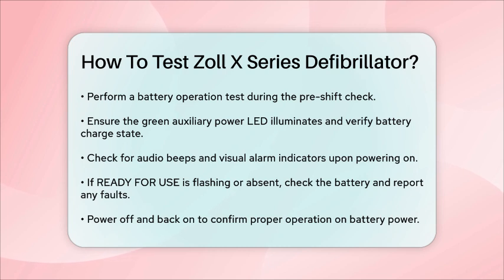Finally, power off the device, then power it back on to ensure it operates correctly on battery power and displays 'self-test passed.' By following these steps, you can ensure your Zoll X-Series defibrillator is always ready to save lives. Remember, these checks are not just routine — they are essential for the safety and effectiveness of the device.